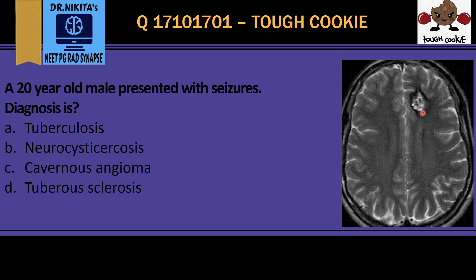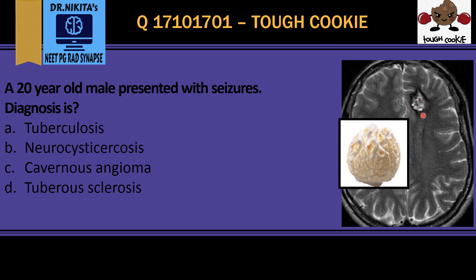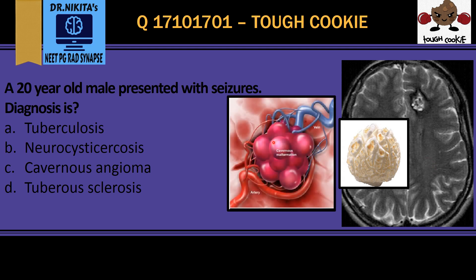The lesion has a multi-loculated, multi-lobulated appearance — again, like that of a popcorn ball. We have a popcorn ball-like appearance with a black ring surrounding it. This black ring is due to hemosiderin. This popcorn-like appearance with a hemosiderin ring on T2-weighted imaging is very classical of a cavernous malformation.